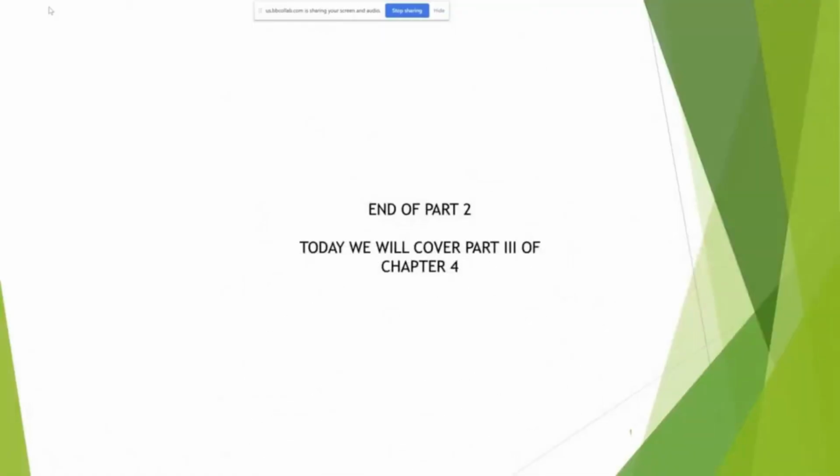Hello, class. Last class we covered chapter 2. I'm sorry, part 2 of chapter 4. Today we're going to be covering part 3 of chapter 4. And today we're going to be largely focusing our attention on the apical four-chamber.